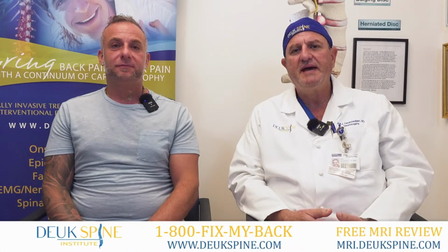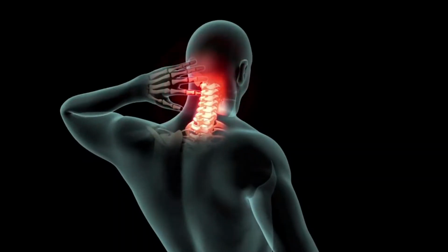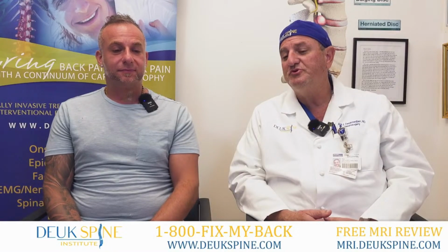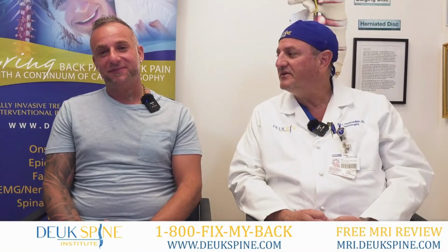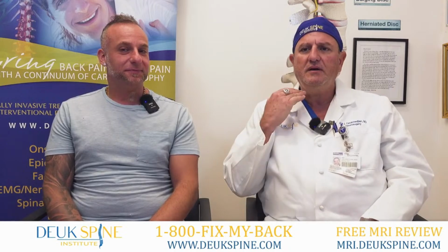Good morning, I'm Dr. Deuk Majan. I'm here with one of my patients from Canada who traveled from Toronto to Florida to have Deuk laser disc repair to fix 2 herniated discs, one in his neck, one in his lower back. You had your lower back done last week, and we were supposed to do your cervical last week, but our air conditioning broke. We got it fixed over the weekend, and you had your neck done yesterday. So you've had the Deuk laser disc repair done on your neck and your lower back.